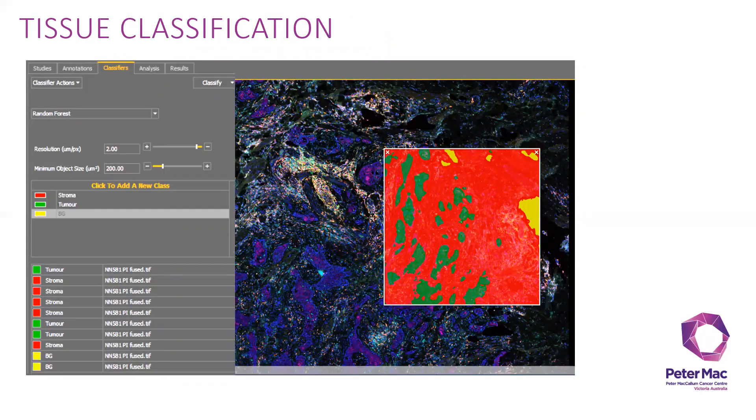Here, as you can see, I have made three different classes for the classification: stroma, tumor, and background. From that, I gave them a few different examples to teach the software on how to classify the different classes here. You can see it has done a pretty good job as shown in the left preview window.